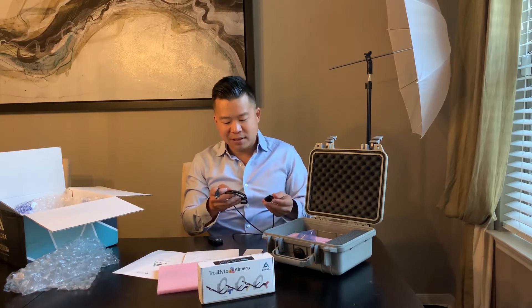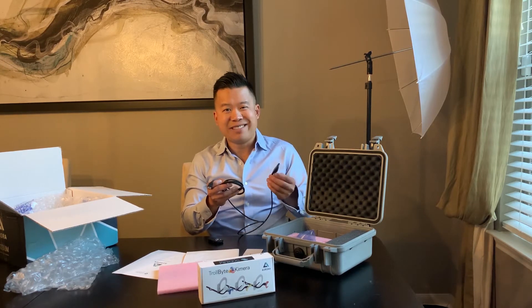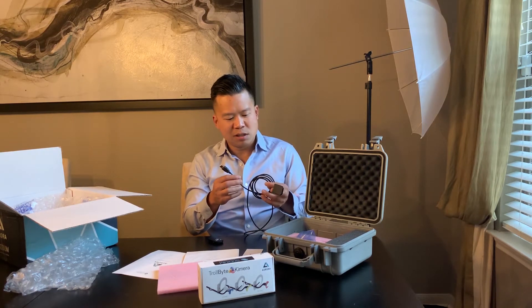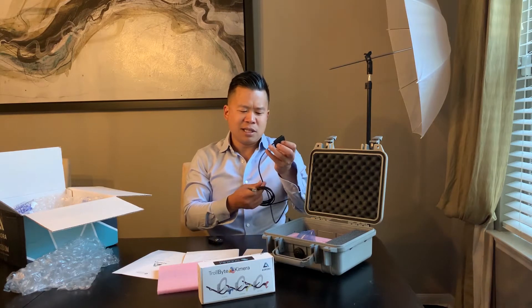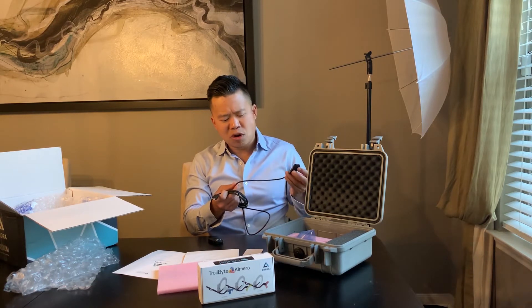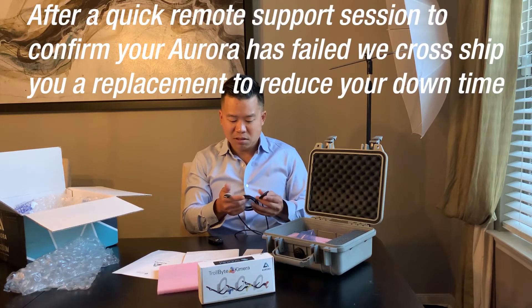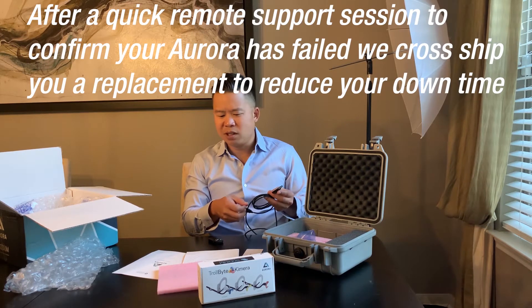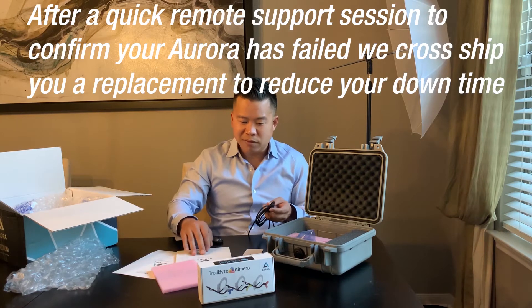This Aurora cord looks nice, thick, and rubbery, which will greatly reduce the risk of damage from kinking. Like I said, if it did have damage, we could just send it off to Sodium Dental, or they could probably cross-ship a new one. That's something to look into. This is a nice looking sensor overall.